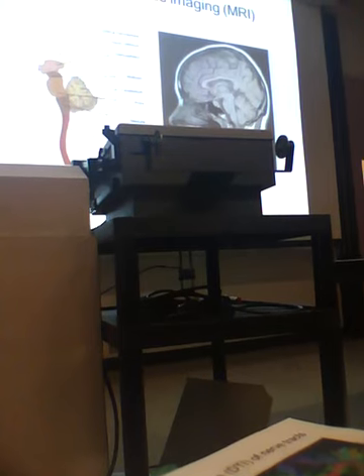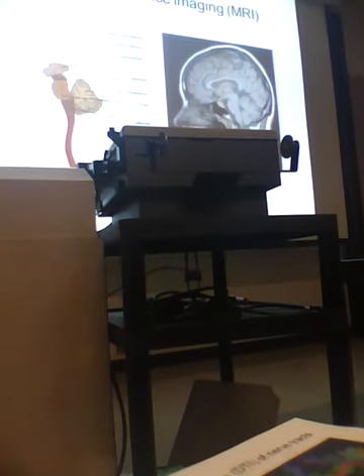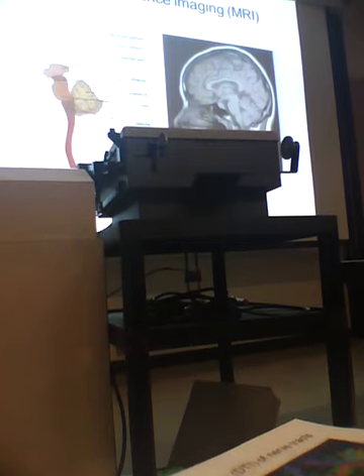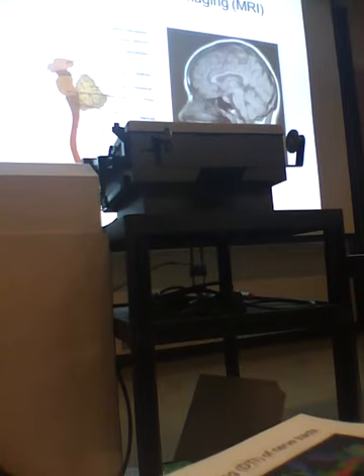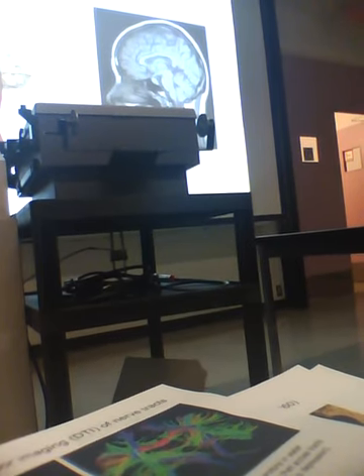Now let's say that this was an injured living brain, then you might see a big white patch up here, or a big dark patch, or something wrong with it. So you can see injury. You can see injuries very easily with this technique in really clear detail. That's one of the nice things about MRI. Its spatial resolution is much higher than CAT scanning. You can see things in much higher detail than with CAT scanning.